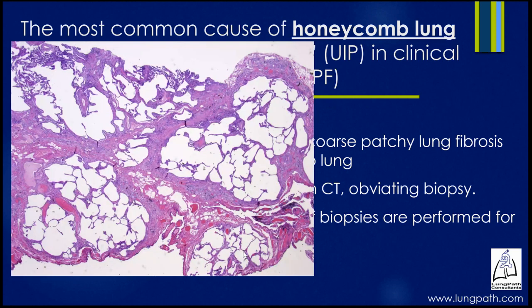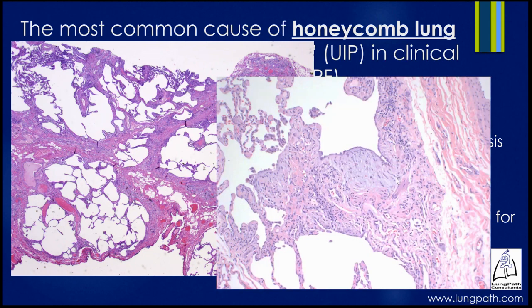So here is the pathology of usual interstitial pneumonia. These are peculiar looking, irregular, rounded areas of fibrosis surrounding relatively normal lung. This is the temporal heterogeneity of UIP, which Tom will talk about in more detail in the next lecture. This structure is similar to the polyps we just looked at of repair and injury. These occur characteristically in usual interstitial pneumonia and other diseases. And you can see there a bulge of fibroblastic proliferation at the edge of fibrosis, and they're lined by type 2 cells on their surface, trying to undergo repair.